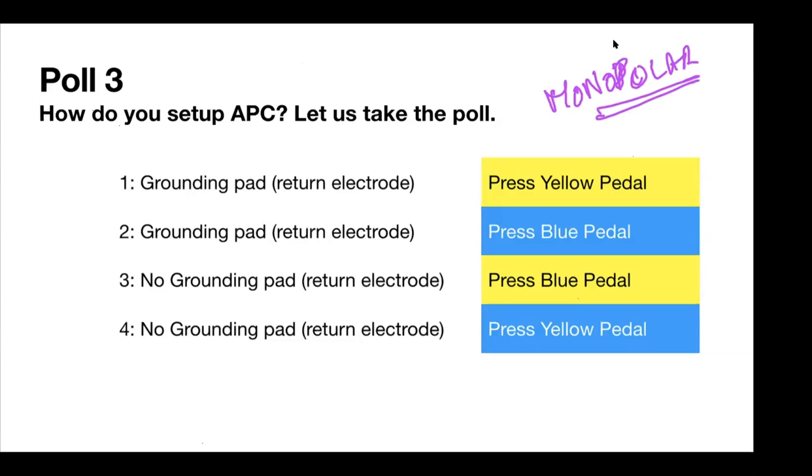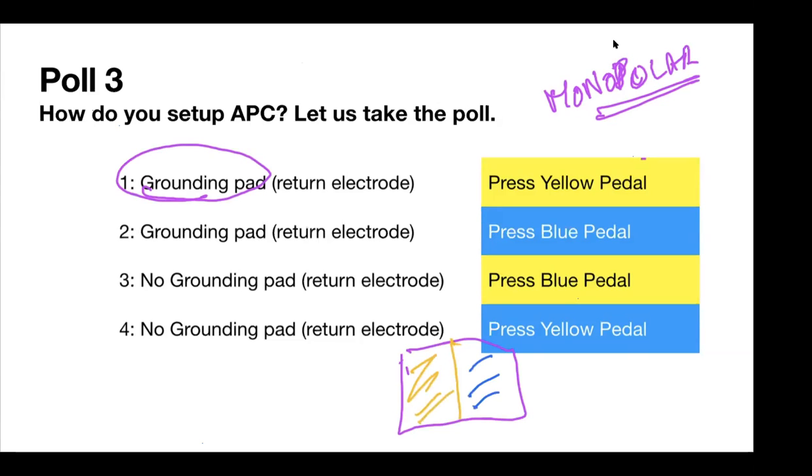And so you have to look at your electrosurgery system and determine, for instance, on an Erbe machine, there's two windows, the yellow side and the blue side. So you're going to have to recognize where the application resides. If you look at the blue side, you'll see the effect and the wattage. That's a direct indicator that you should be using the blue pedal, because that's where you dictate the type of APC mode that you want to apply.